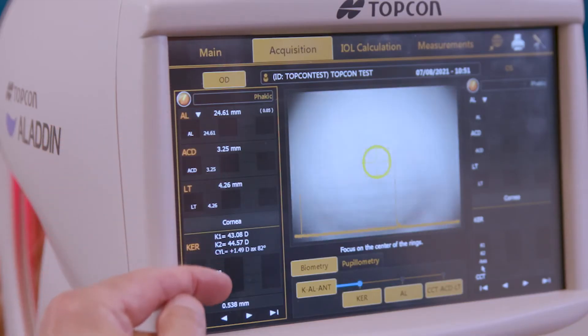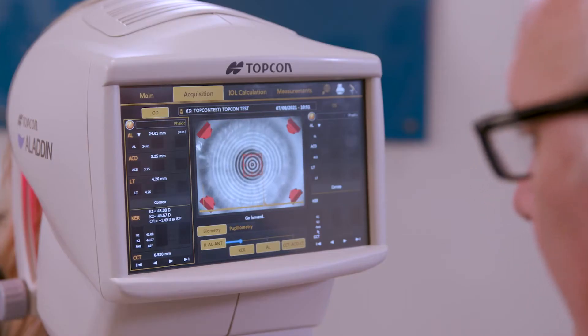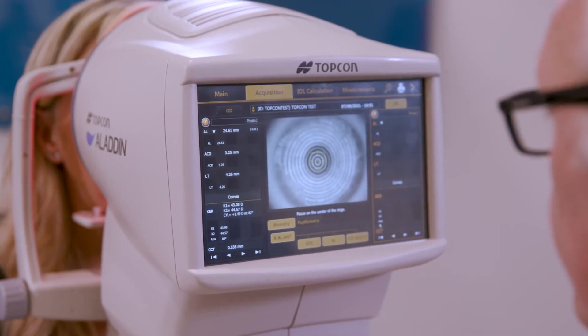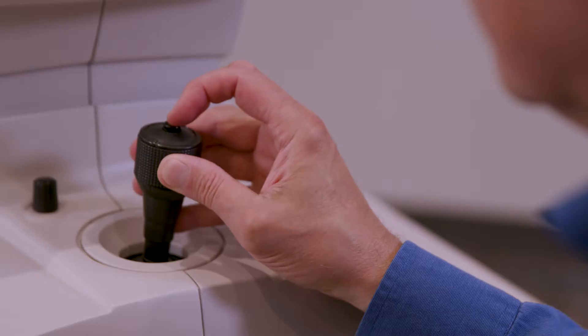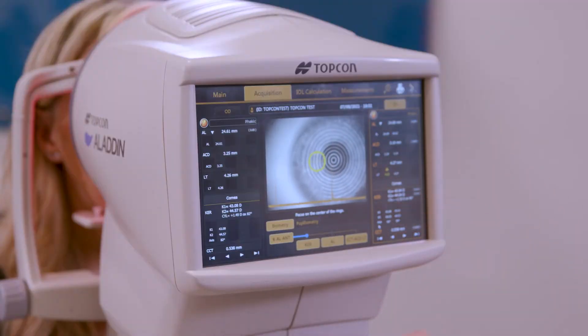When all the numbers appear in white, it means that the measurement is correct and accurate. Now we have all the numbers in white, meaning that both eyes have been properly measured.